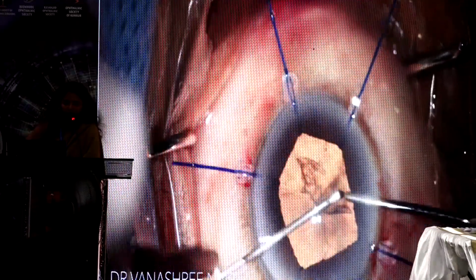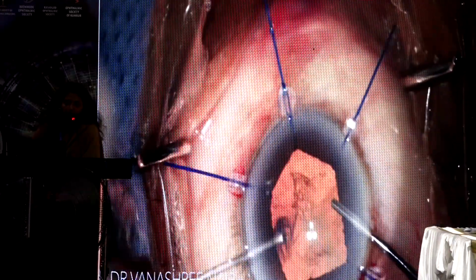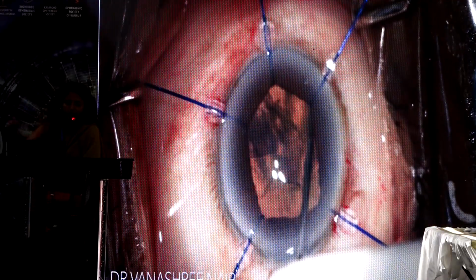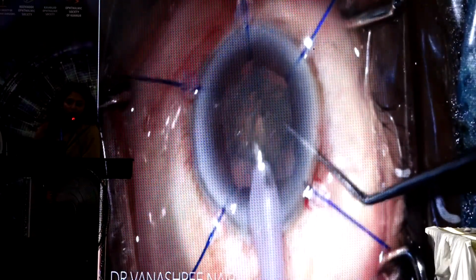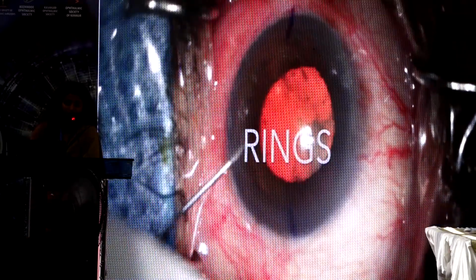I prefer the hexagonal opening, but some people prefer 4 hooks giving a diamond shape opening, but I don't stretch it right up to the periphery. And my phaco probe is usually not having a hook below it. I do not find it a problem; the iris has never come prolapsed to the main port in my case.